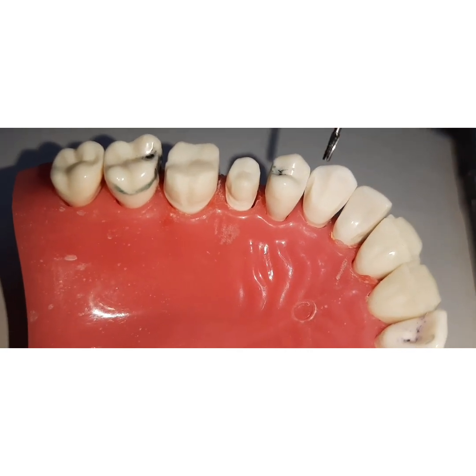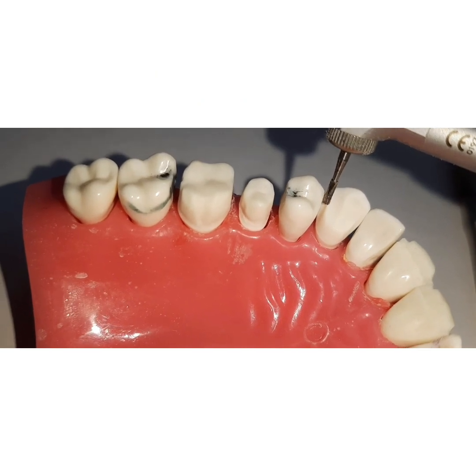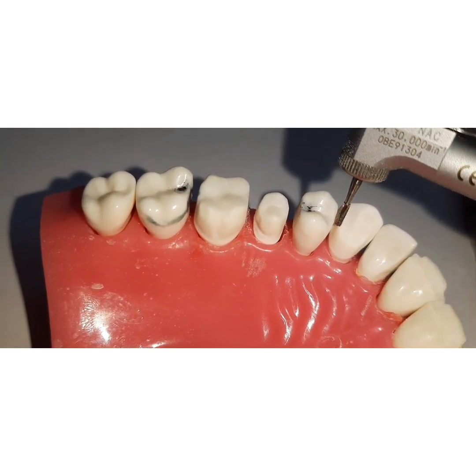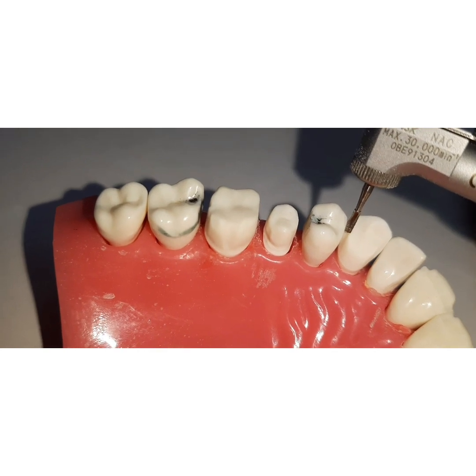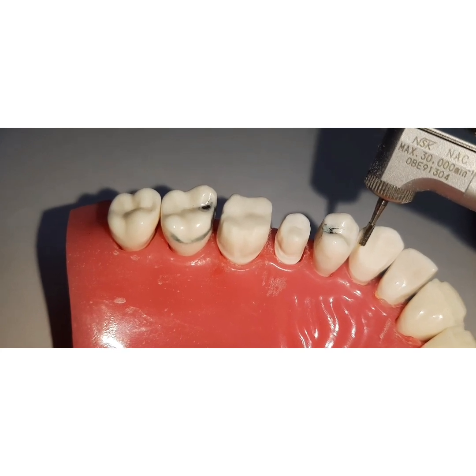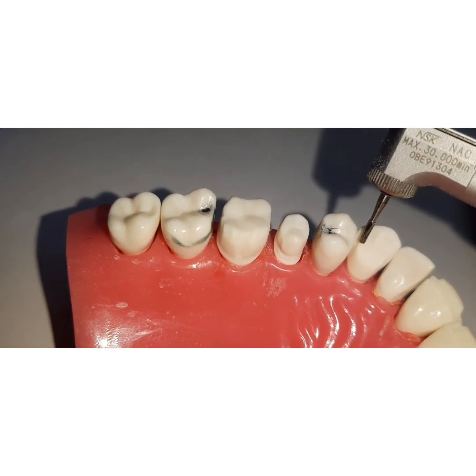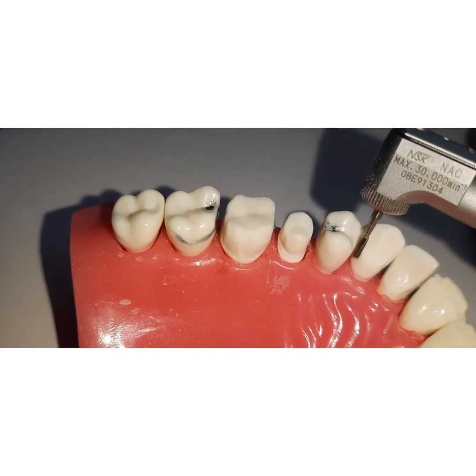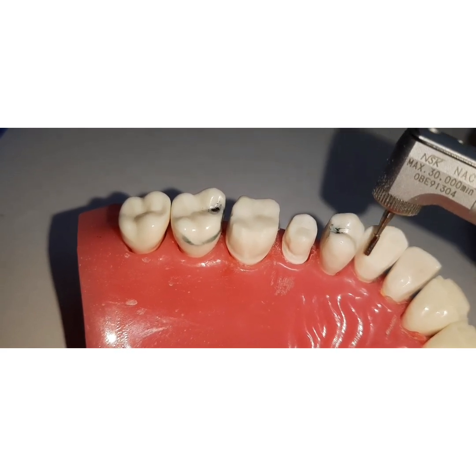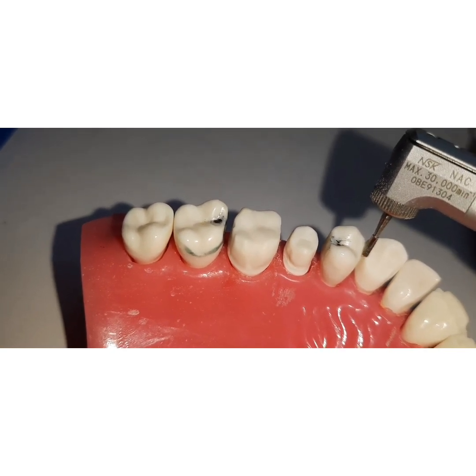The next important step is to give a proximal groove using a number 170L bur. Go straight, parallel to the incisal two-thirds of the tooth, going directly into the surface. Make sure the bur does not penetrate or make the labial surface thin. Go parallel to the surface on both sides to create the proximal groove. Make sure you stop at least 0.5 mm above the chamfer finish line.